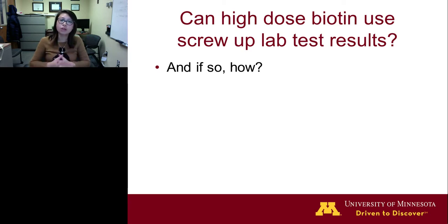Because so far we talked about biotin being an important component in many of those immunoassay tests used in the clinical lab. Historically, because there was no use of large doses of biotin, the natural level of biotin, which is very low in the blood, is not going to cause any interference. However, there's a recent trend of using large doses of biotin for medical and health reasons. So whether this new trend is going to cause lab test interference, the answer to this question is yes.